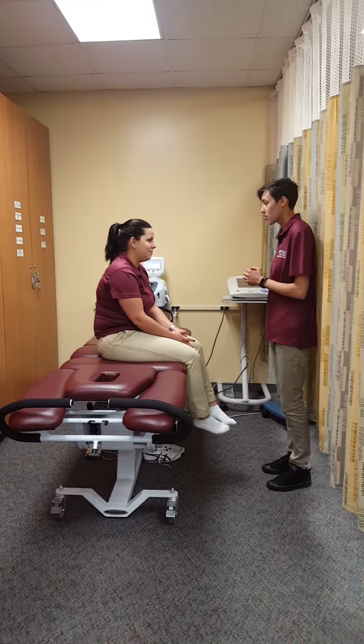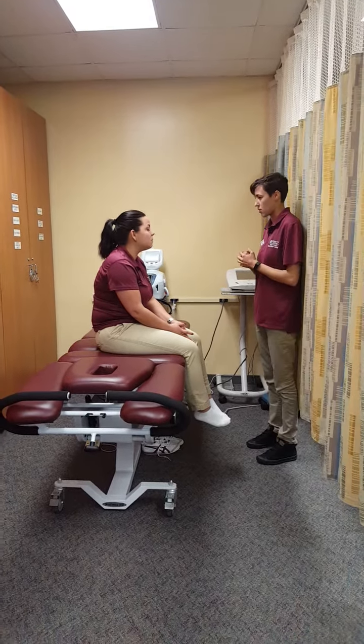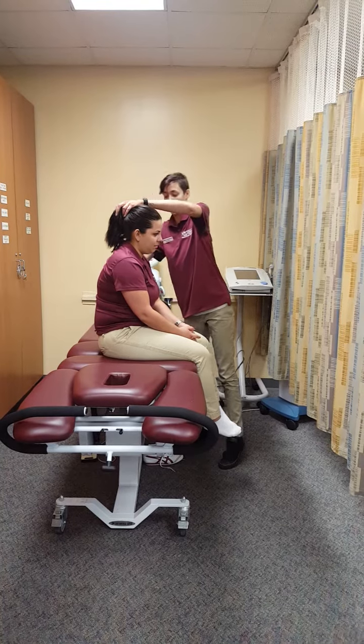Alright, so I see you have your shoes taken off. I'm just going to check your skin. Do you feel my touch? Awesome. I see no swelling or redness, so we're ready to go.